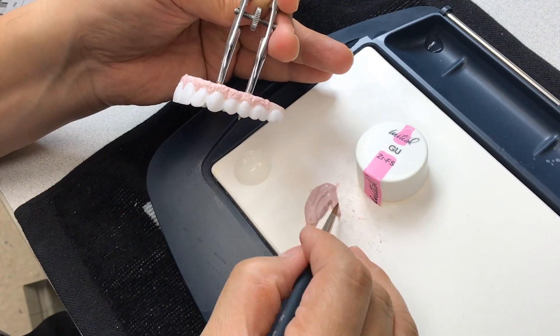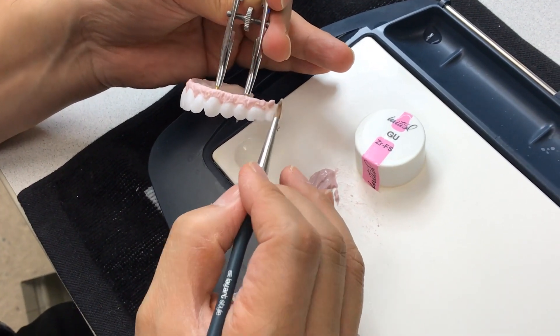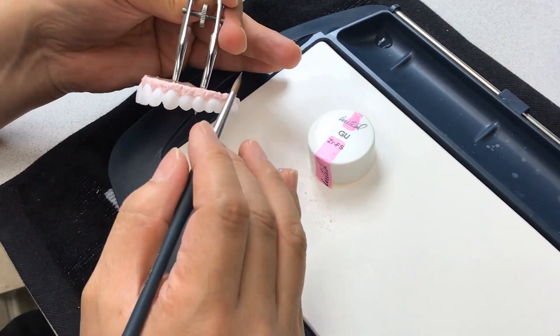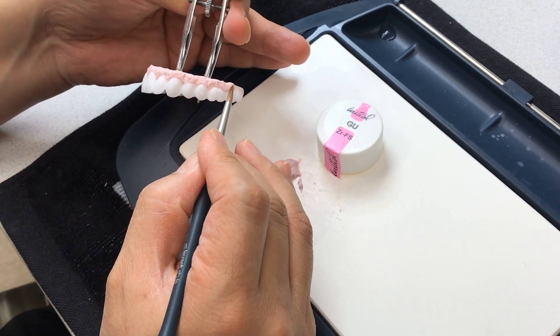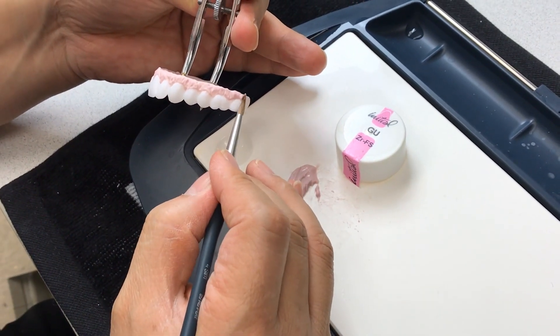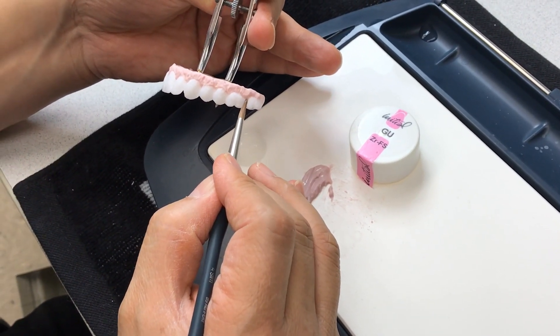Usually how many times do I bake? Usually I bake two to three times easy, because I have to use different porcelain colors. After you fire it, then you can see the result. That's it.